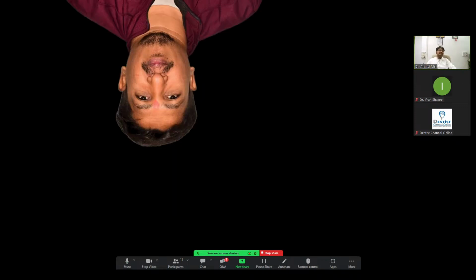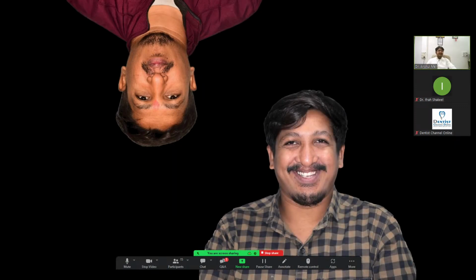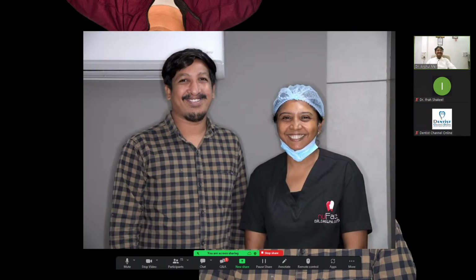The patient came to us without a smile, and now has a smile. But the most important thing is the smile of the doctor. You can see the smile of the doctor is more than the patient's, because we transferred the same occlusion without any hassle, without multiple impressions. In this case we have a hanging pre-maxilla, so it is difficult to take an impression. All of it was sorted out within 3 appointments. That's why the doctor is happier than the patient.